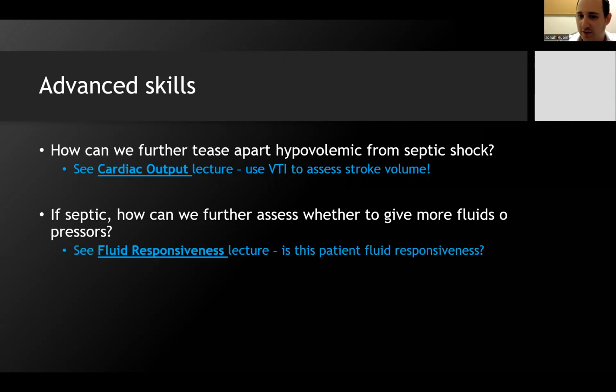So we had a whole lecture on fluid responsiveness, right? So how can you use echo to help guide whether or not this patient's fluid responsive? Although I also said that echo is probably not the best way to do it. Yep, but passive leg raise and VTI would probably be the best way with an echo if you did.